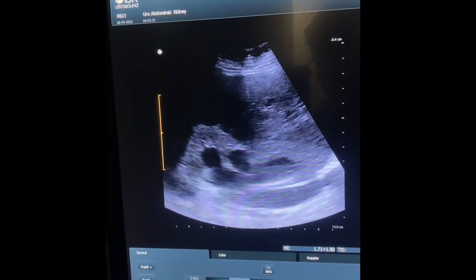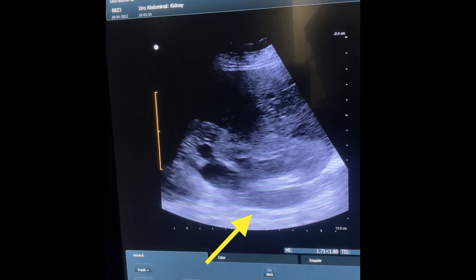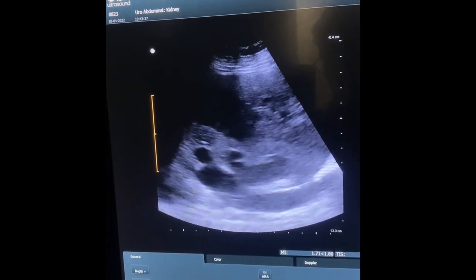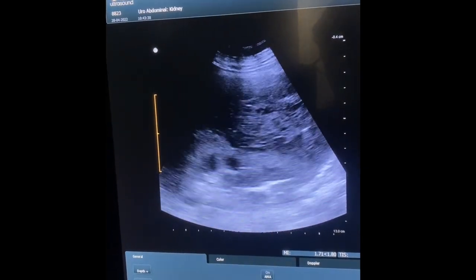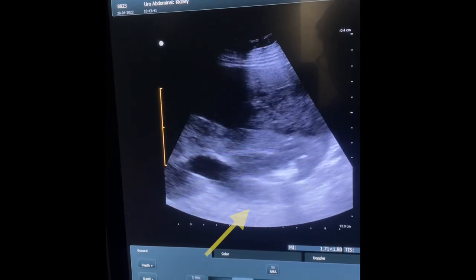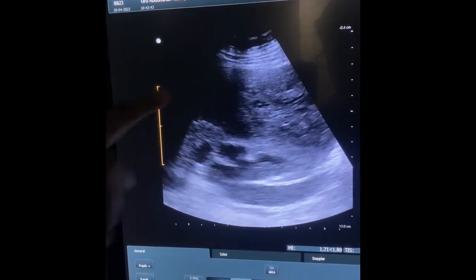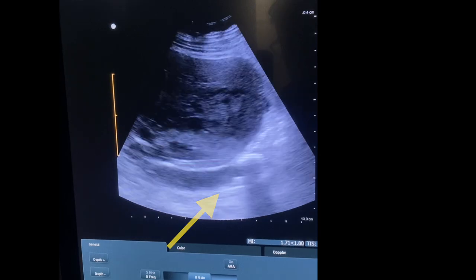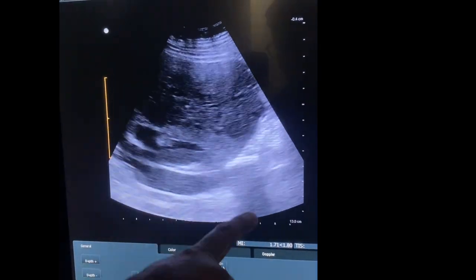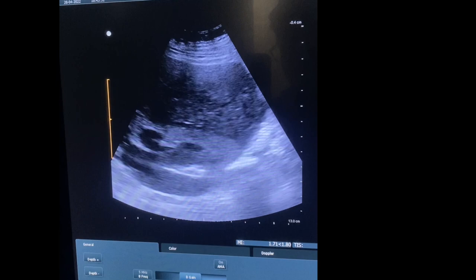The ureter is being assessed — it is generally found more medially, and by slowly dragging the probe down, you can trace the ureter. When tracing the ureter down, you can clearly identify an echogenic shadow in the upper ureter suggestive of a stone, which is also casting an acoustic shadow.